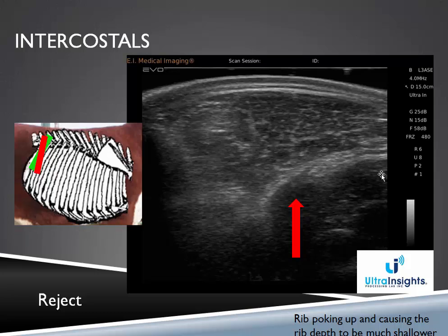So if we treat every animal the same and we expect the image to be collected between the ribs, then processing an image like this would grossly underestimate the ribeye area. So that's why it's rejected. It's because it's collected too straight across the rib.